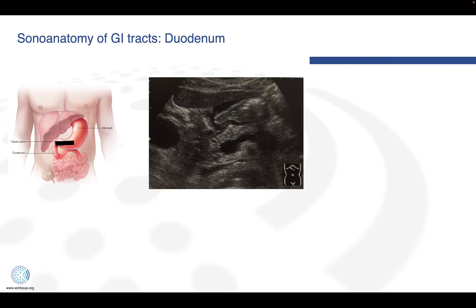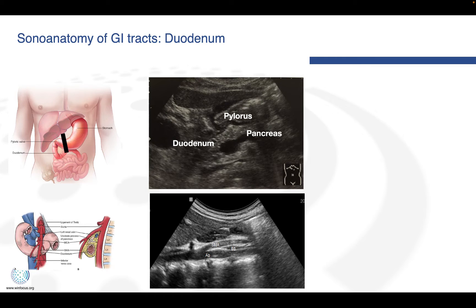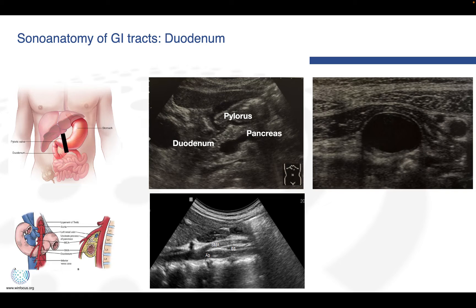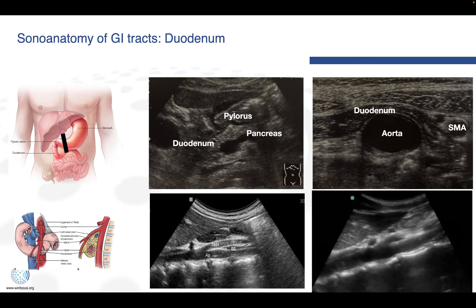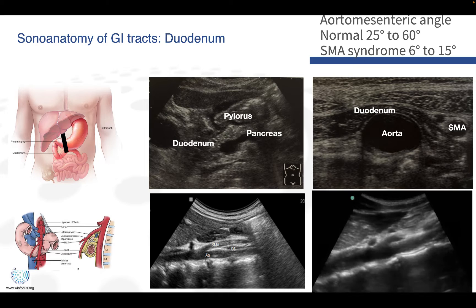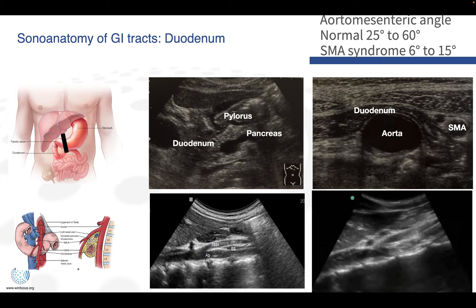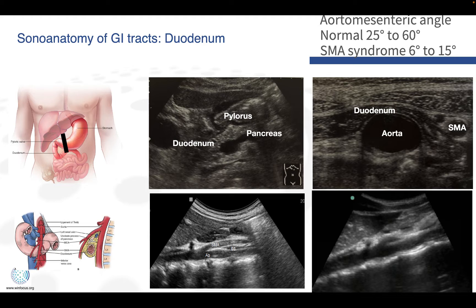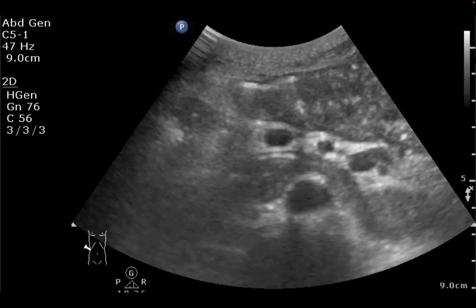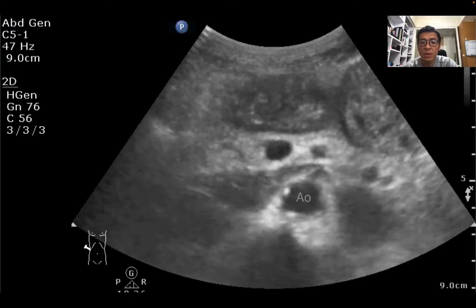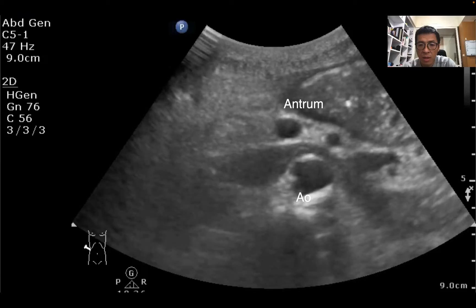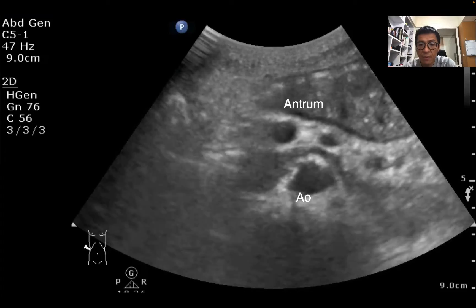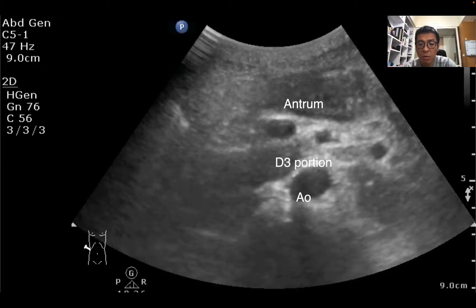The next GI structure goes to the duodenum. We can start with a transverse scan from pylorus to duodenum. You can also rotate the transducer sagittally to observe the third portion in between the SMA and aorta. When you have patients with a distended stomach and duodenum, you should observe the angle between the SMA and aorta. If the angle is smaller than it should be, you should consider the patient may have SMA syndrome. We can see the typical landmark — aorta and antrum, and the GI structures passing in between the aorta and SMA is the third portion of the duodenum.